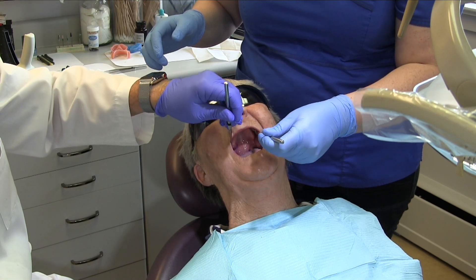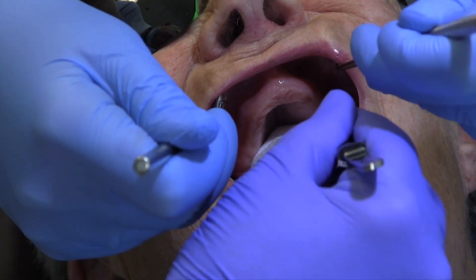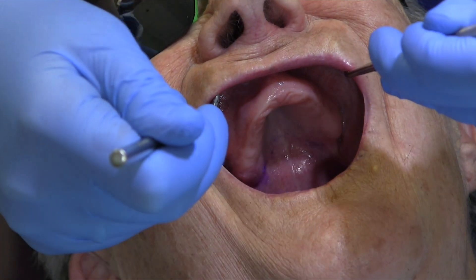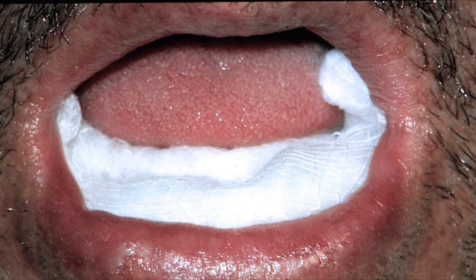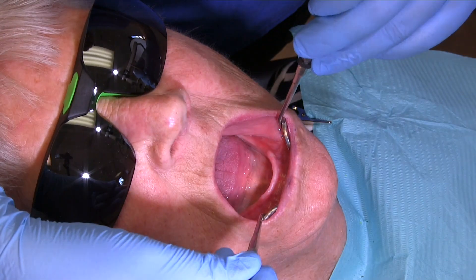Prepare the patient for the impression. Lightly and quickly dry the tissues with folded gauze using cotton pliers to minimize repeated contact that could stimulate salivation. In the mandible, use a similar technique unless there is excess pooling. In the latter case, you may find that placing two to three folded pieces of gauze over the vestibules to be a better strategy. Remove them with cotton pliers just prior to making the impression.